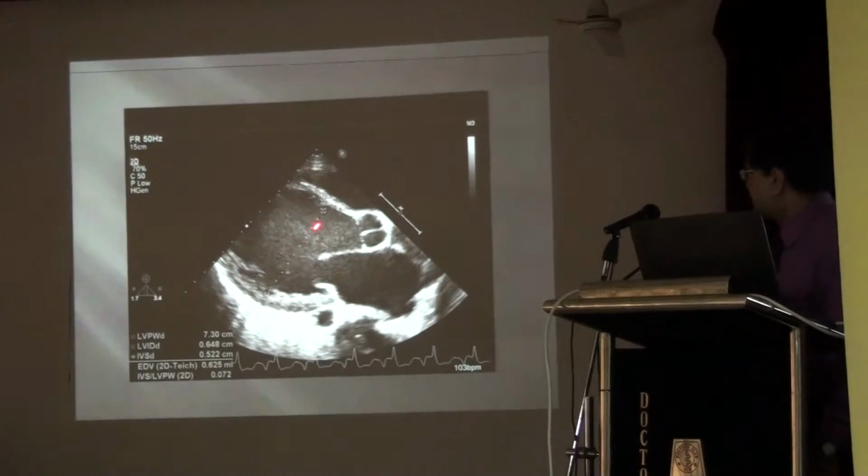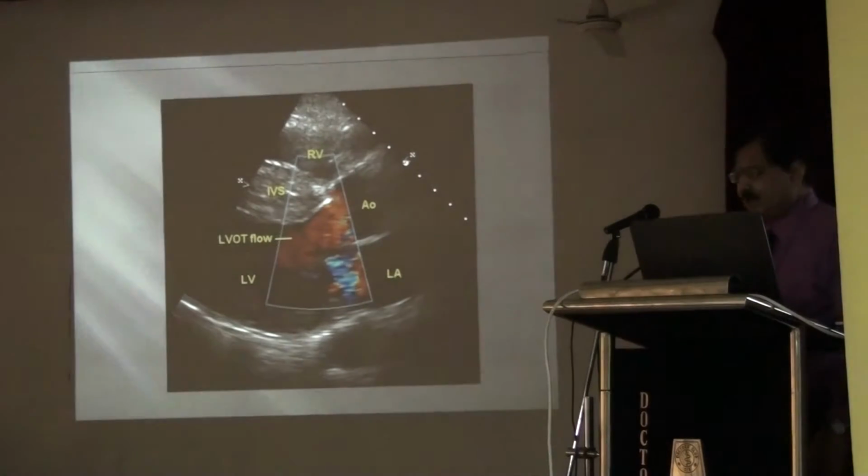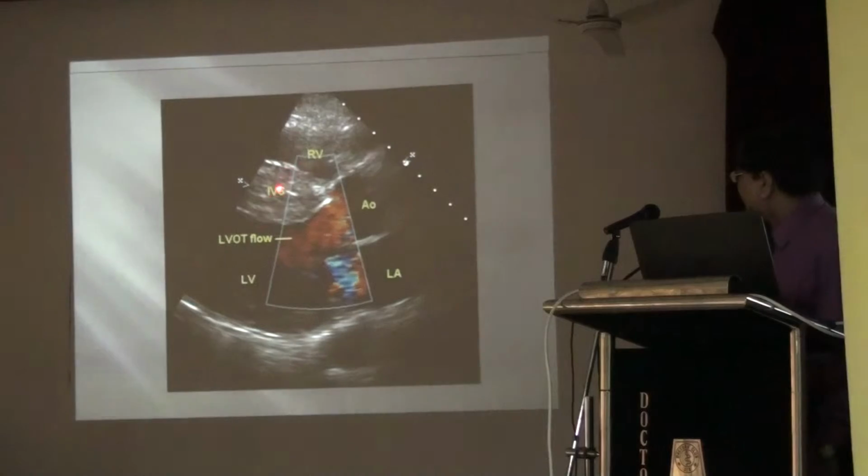So dilated cardiomyopathy is one of the important things we can see immediately, and see how much it is. Your normal diameter is 5.5; here it is 6.4 centimeters. So there is thinning of the septum and dilatation of the chamber. This is the DCM.